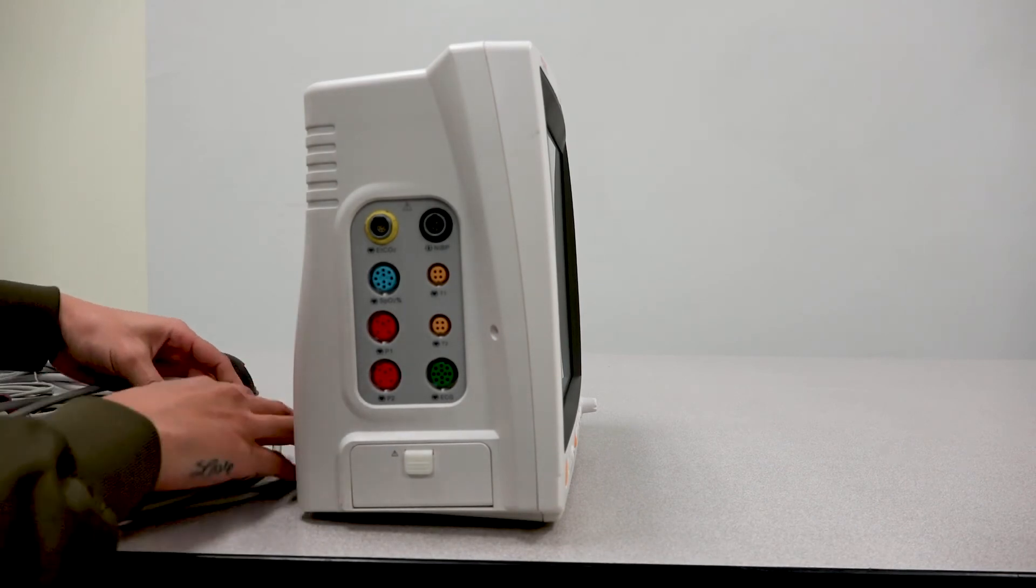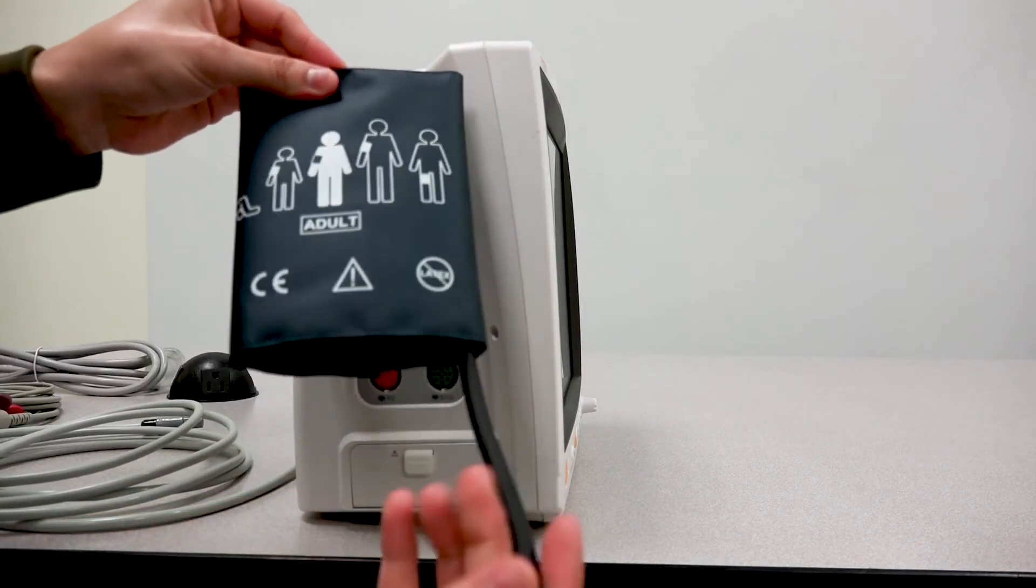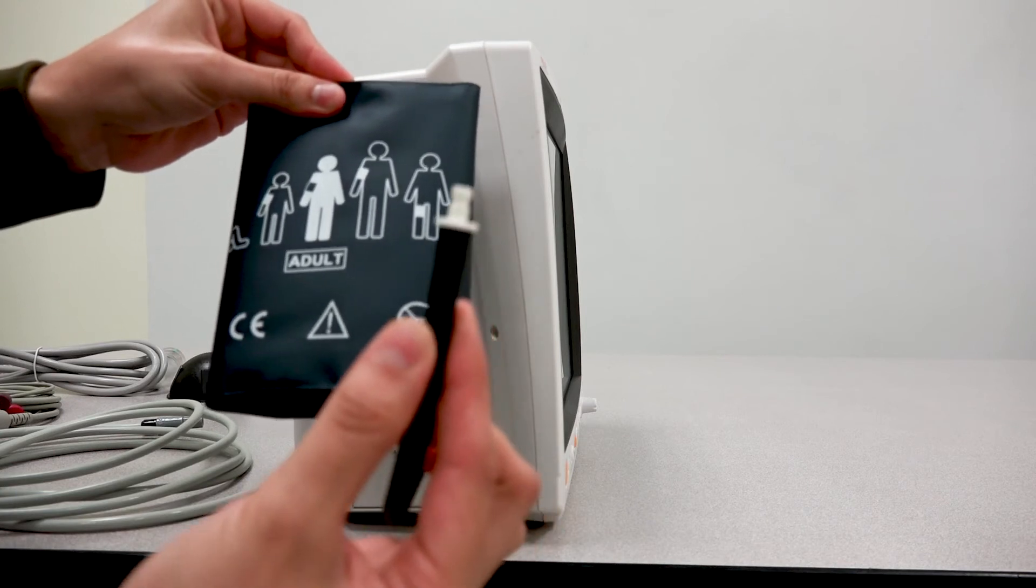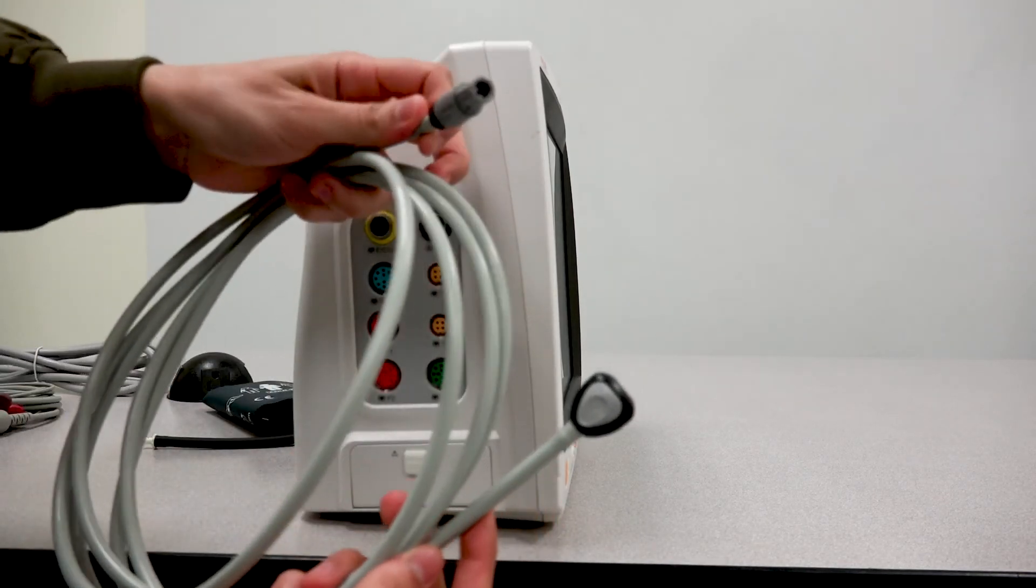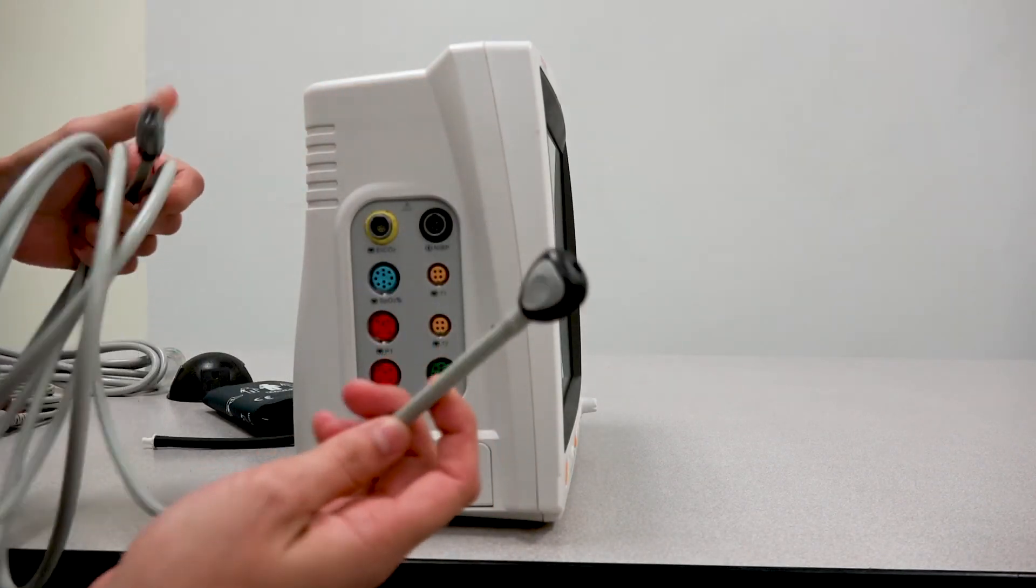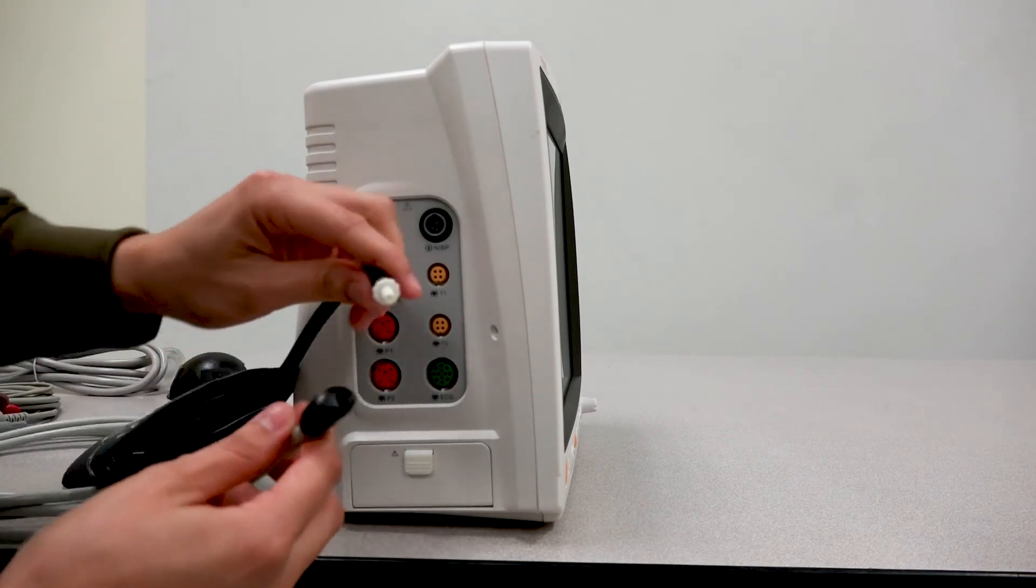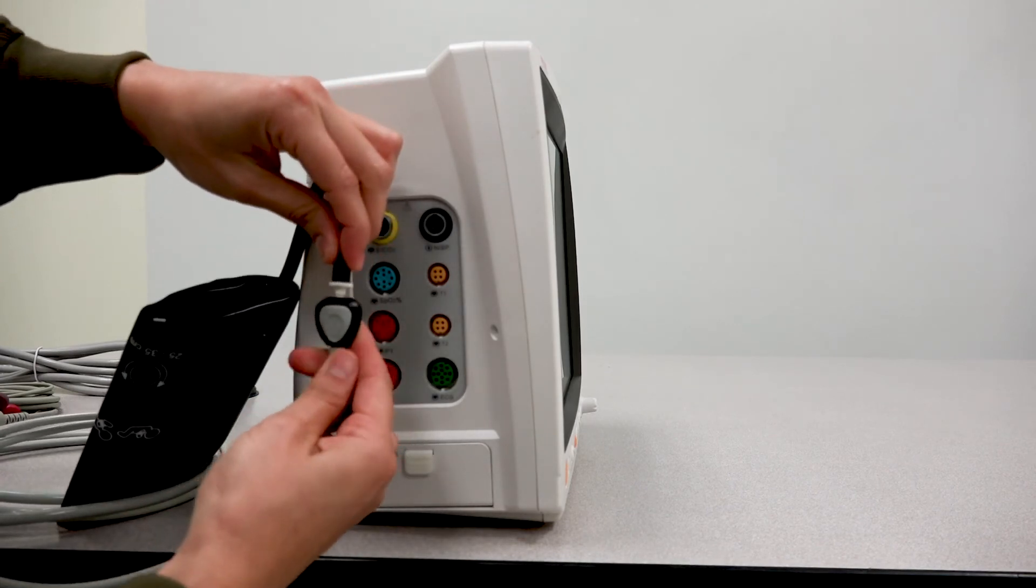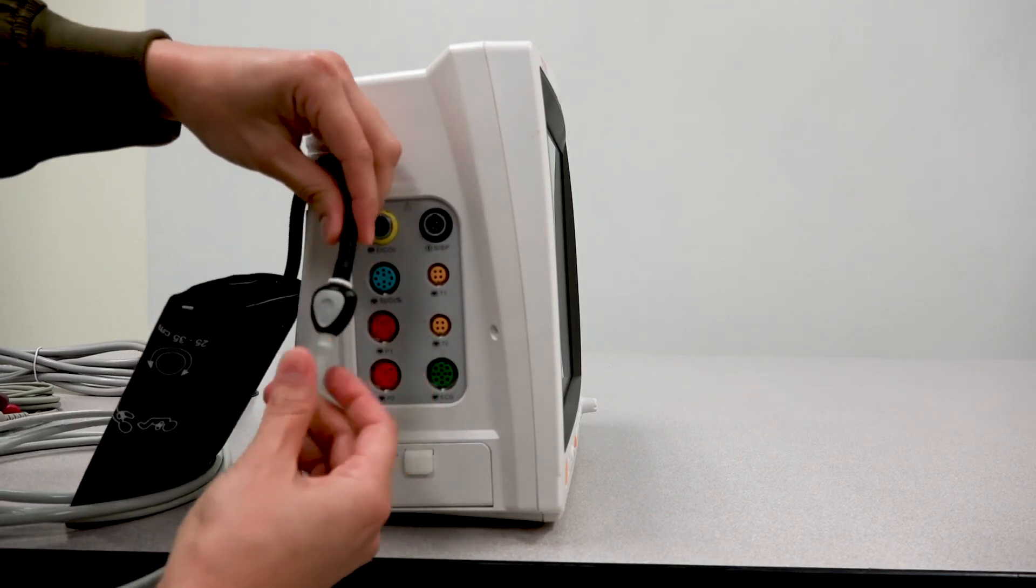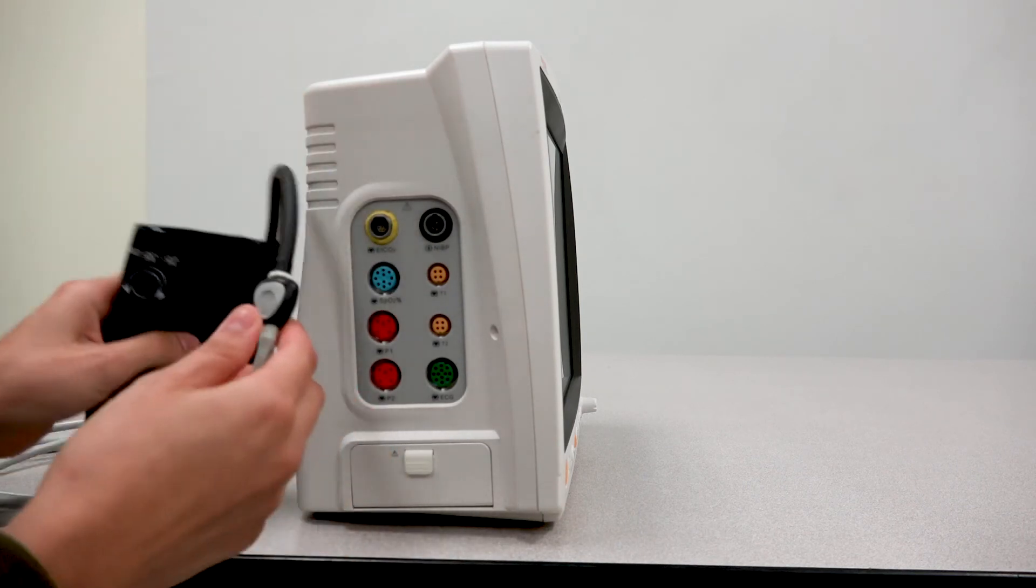We have here the NIBP accessories. You have your NIBP tubing and your cuff. This is the connector part here. And then you have your actual NIBP tubing. You have this side that connects to the monitor and this side that will connect to the cuff. With the cuff, you'll grab the tubing on it. This little white connector will gently go into this side. You'll hear a click and now it will be secured.